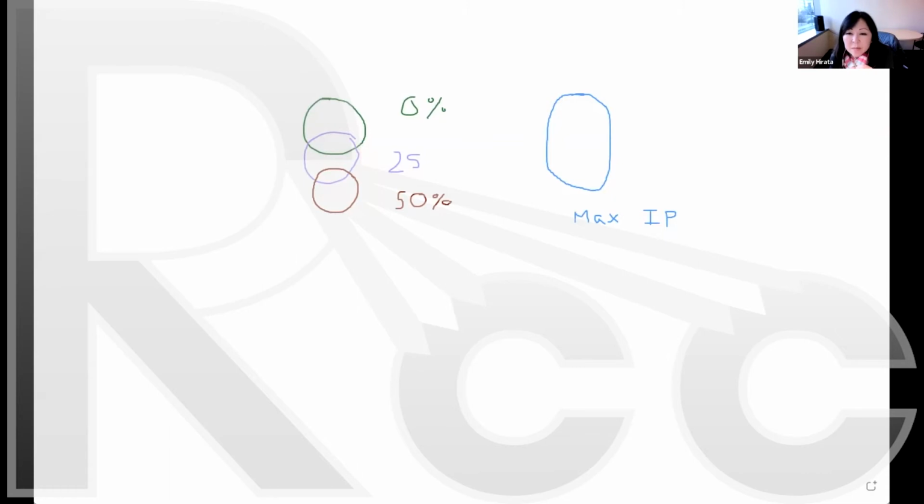In this particular example, it would be something like this and something like this. But generally speaking, we don't have quite the same. And that's your min. I would say for practical purposes, just don't think about the min. We never use the minimum intensity projection for anything.